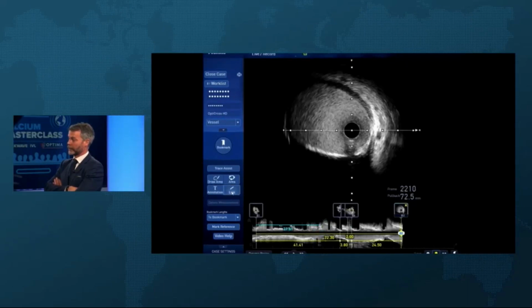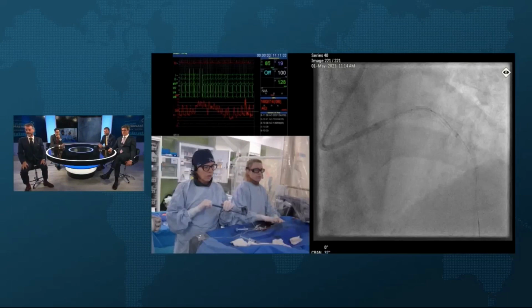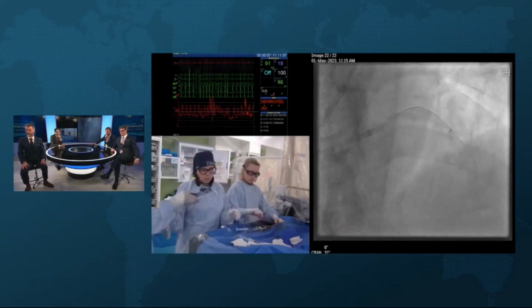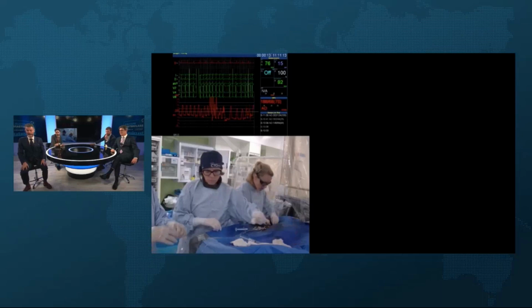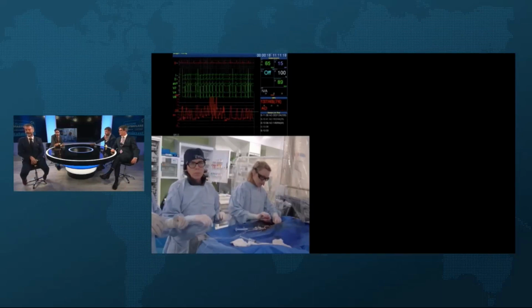It's pretty big. So as is often the case, it's ovoid. So it's probably back here somewhere, I guess. What about the thicker stent struts for preventing nodular reprotrusion? Does anybody think it reduces the risk of nodular reprotrusion, especially with eruptives? It's a great question, isn't it? I mean, who knows? But it's certainly a very important point to think about.